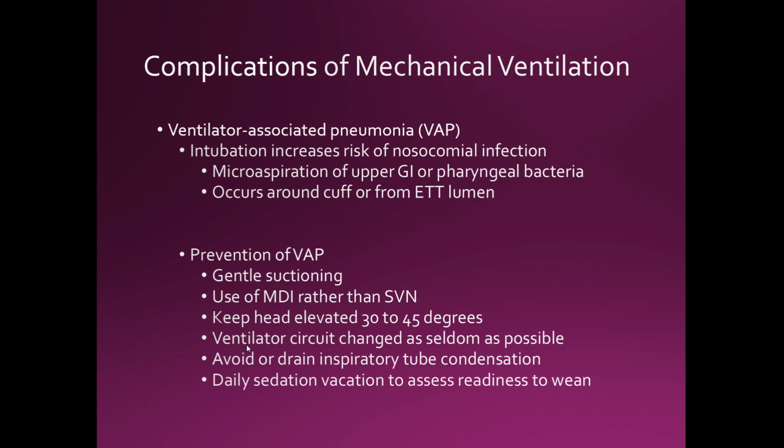If you have a tracheostomy tube with a Ballard, you might see a lot of fluid buildup in the Ballard. If not, you might see it inside the HME, if they have a strong cough and copious amounts of secretions. So you want to clear that out of the way. Last but not least, daily sedation vacation to assess readiness to wean. So we don't want to continuously sedate the patient. We want to make sure that we can assess them when they're fully awake, so we can determine the readiness for them to wean.